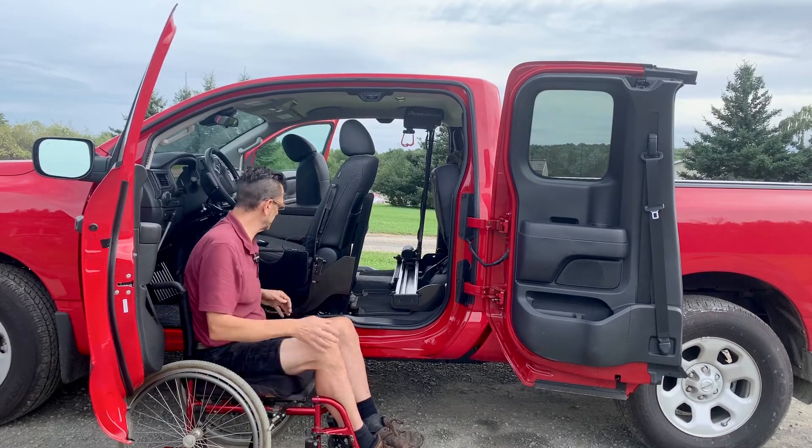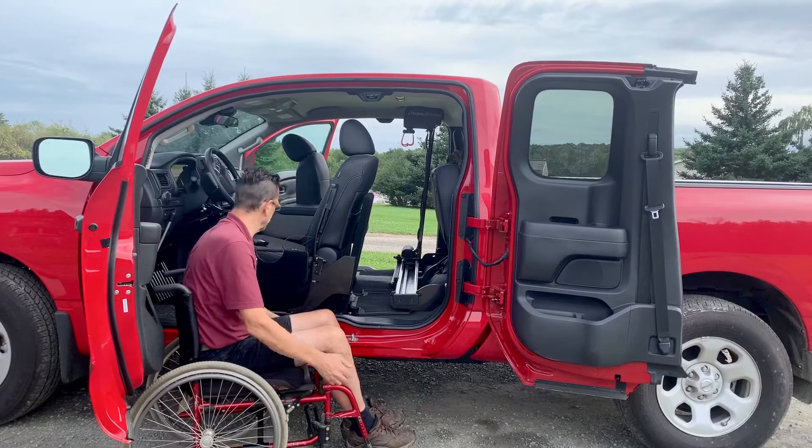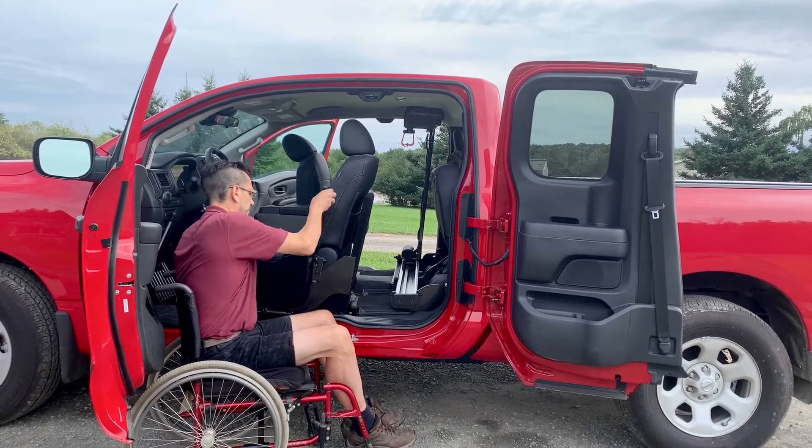First, I'm going to introduce you to the Glide and Go, but I'm going to show you a little bit of the mounting system — how it mounts and why that's important for your particular needs.